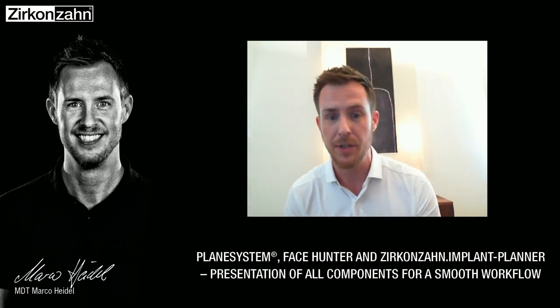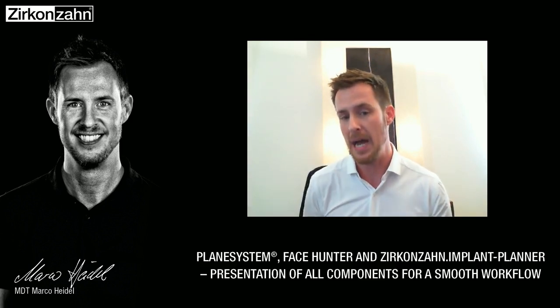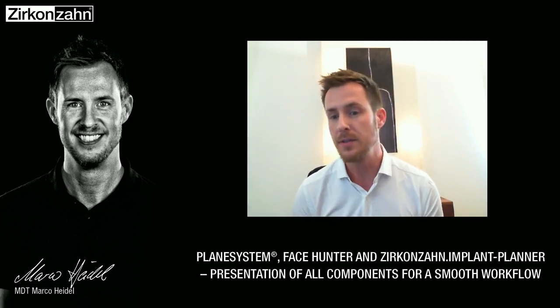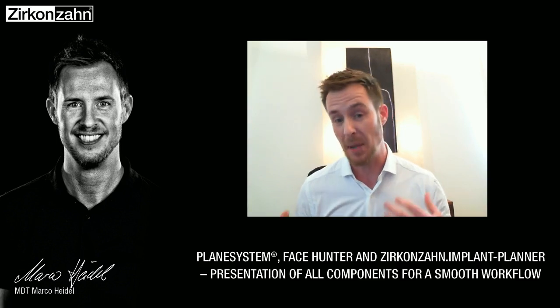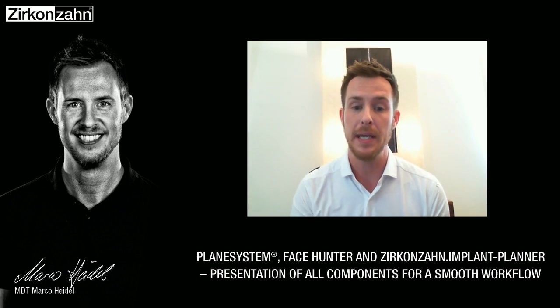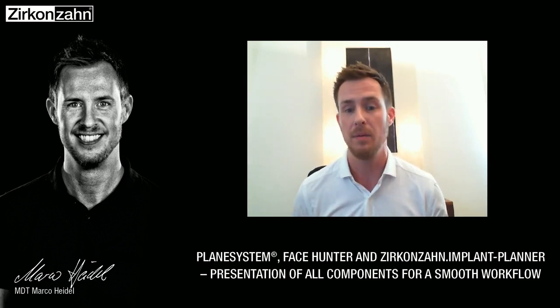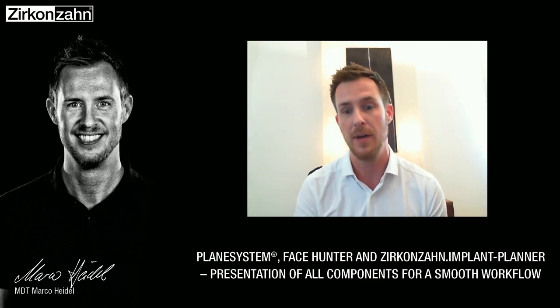Here I also made small infiltrations, small effects, and if you want to have internal effects, then it's time before you build the porcelain onto it to make some small internal stainings. It's really nice to use our 3D staining kit for that, based on porcelain, so it's a very nice effect coming through the actual porcelain you build on it. So this is the final product. Just use enamel. It looks like you built the whole tooth from the ground with porcelain. It's a very nice effect, very clever.